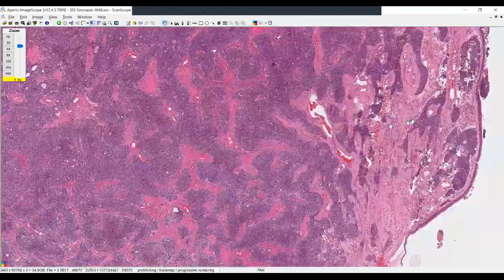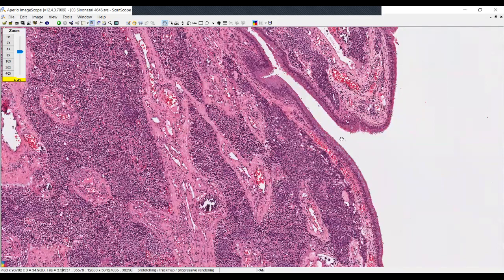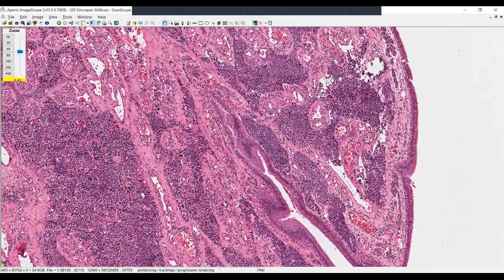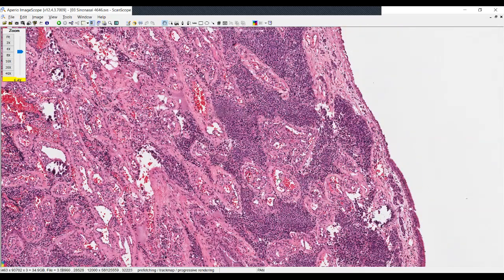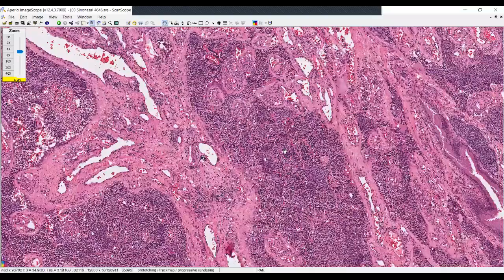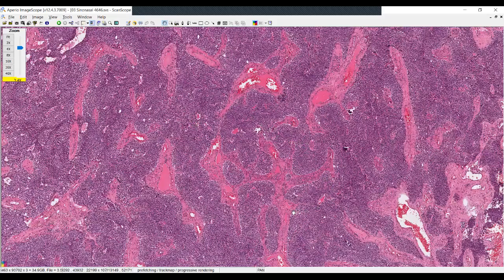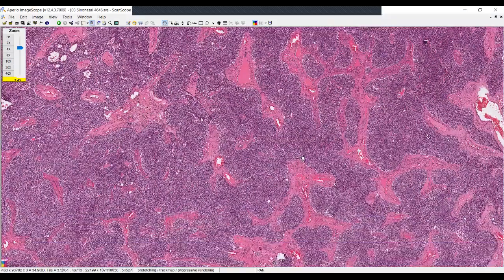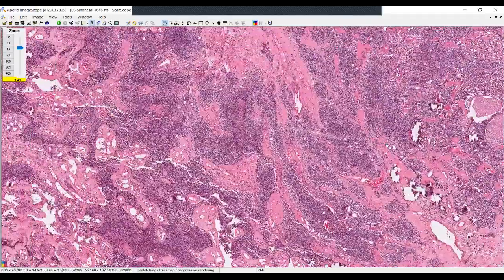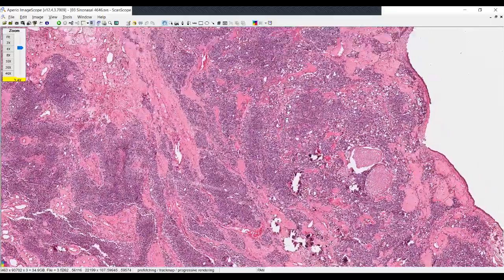So as I go around the periphery, it's nice to get a feel for, is the lesion arising from that surface or is it actually below it? And I think in this case, it is quite evident that it is below that epithelium. Trying to see pagetoid spread is really what you're doing in that case. There are areas of calcification easily identified as well. But what I think is quite remarkable is the multiple areas of a lobular architectural arrangement as I look at this on intermediate power, and it doesn't really matter which one of these 2 fragments you review. There really is a very well-developed appearance of a lobular architecture.